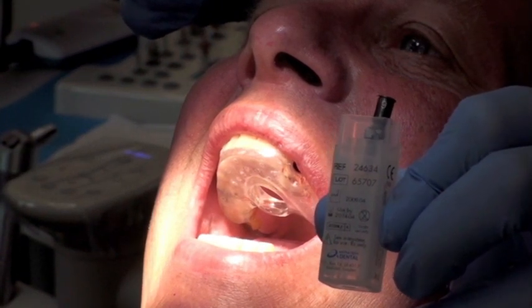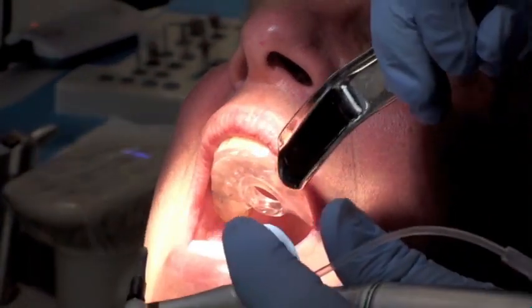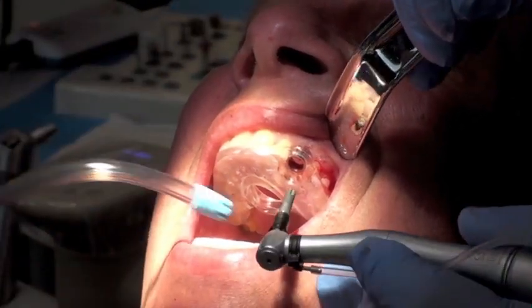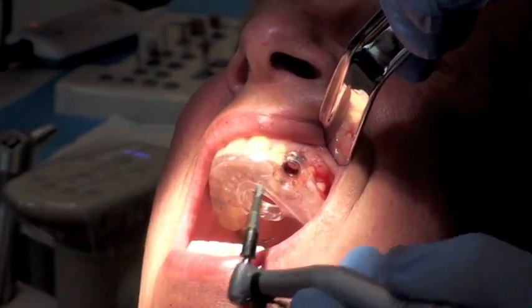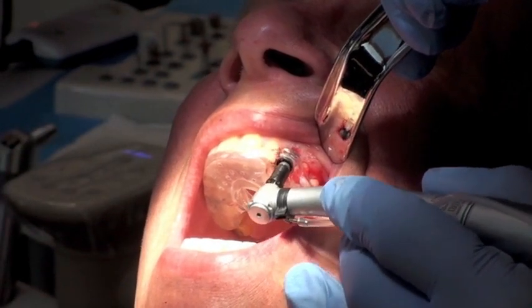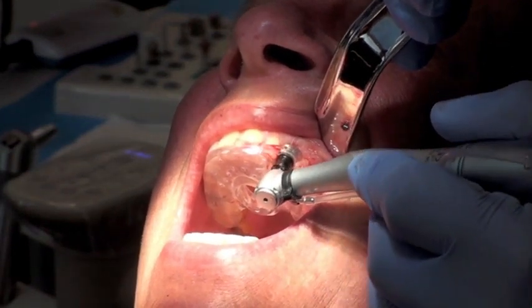What you see here is a 9mm implant holder on top of the 4.5 Astra OsseoSpeed implant. You can see that complex here attached to my handpiece, and we're actually going to be inserting this implant at a torque of 25 Newton centimeters with heavy or copious irrigation. There is a stopper that's built into the implant holder.